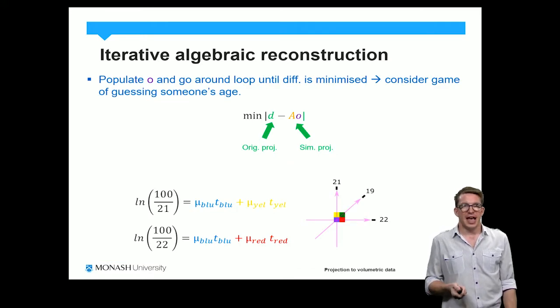So this is the iterative algebraic way of doing the reconstruction process. And we can see that all it's effectively doing is solving all of these linear equations that we can see at the bottom of the screen.